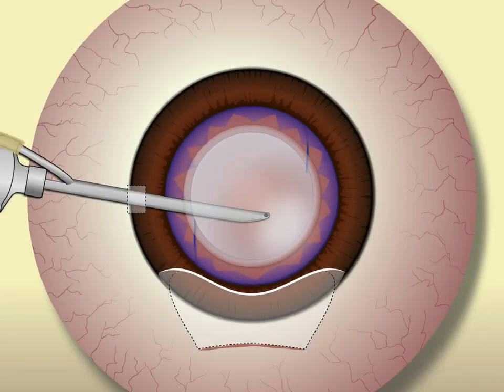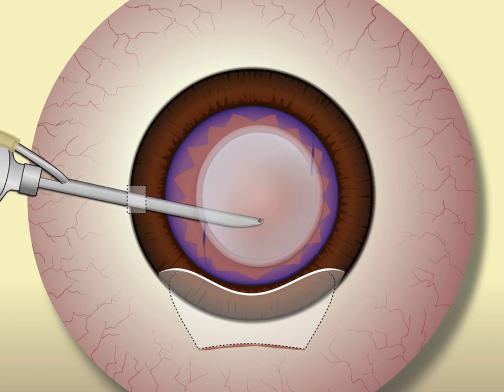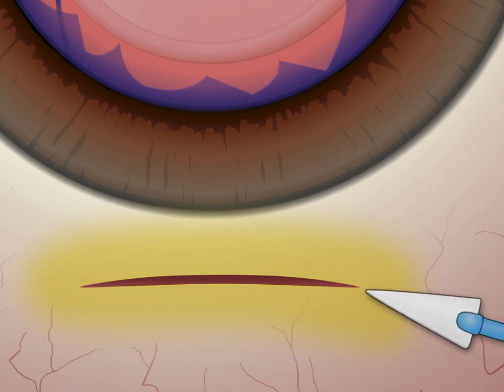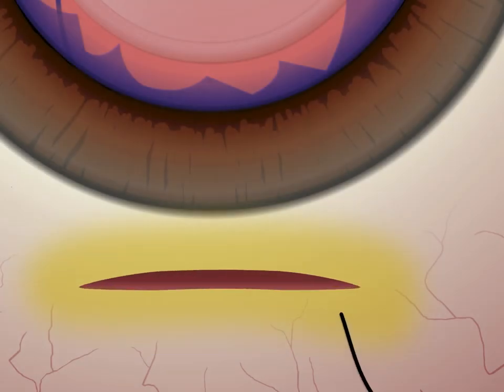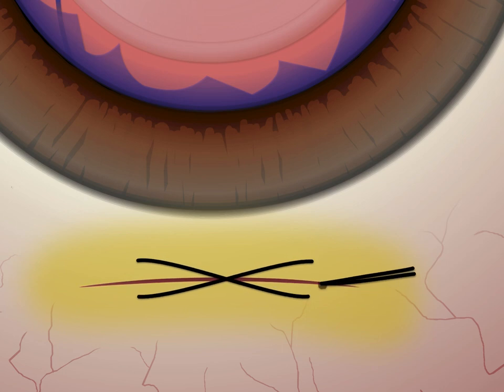After IOL placement, the Simcoe device can be used to remove OVD from the anterior chamber and from behind the IOL. The incisions are then hydrated and checked with gentle pressure and a fluorescent strip to ensure a watertight closure. If there is evidence of a leak, a single running 10-0 nylon X-suture with the knot buried within the incision will generally provide a watertight closure.